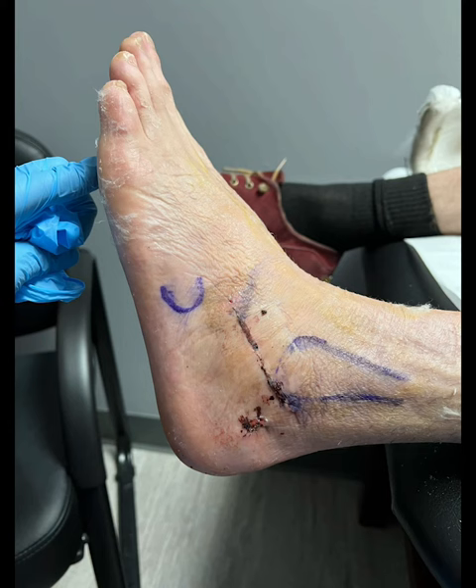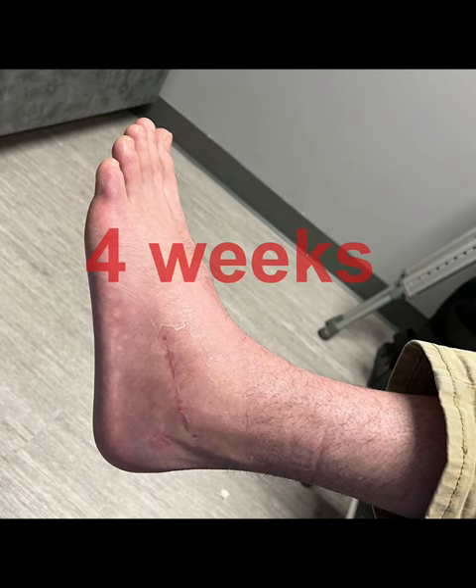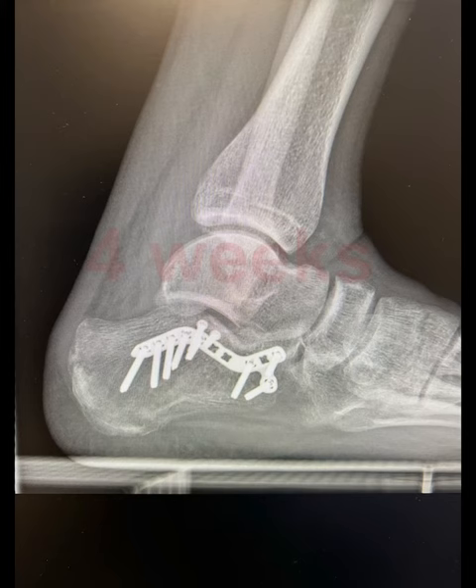Here's a medial oblique, and here's the patient two weeks postoperatively and four weeks postoperatively. Here are some other final x-rays with the patient now weight bearing.